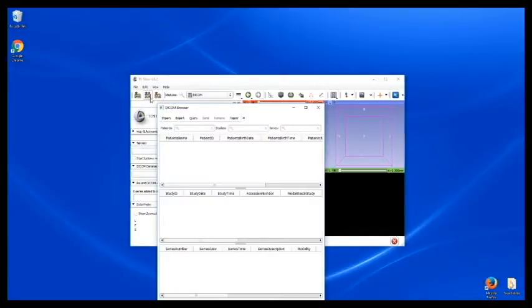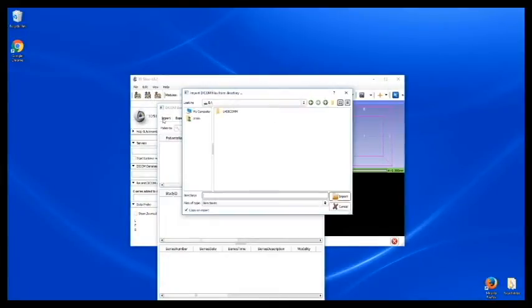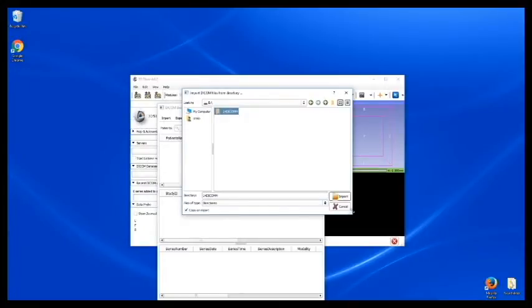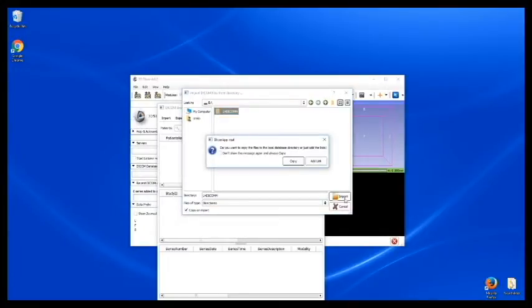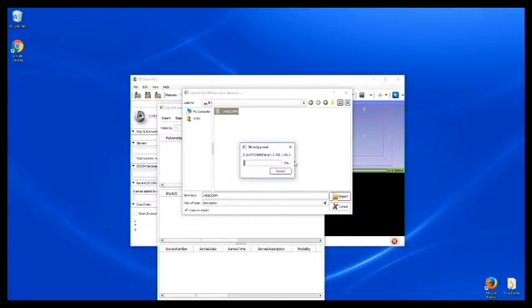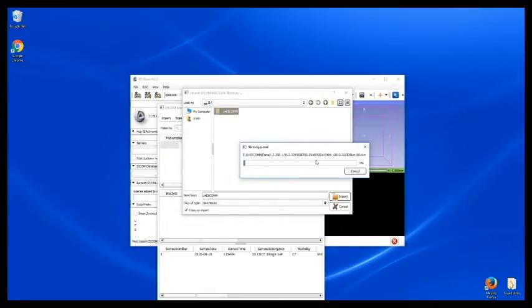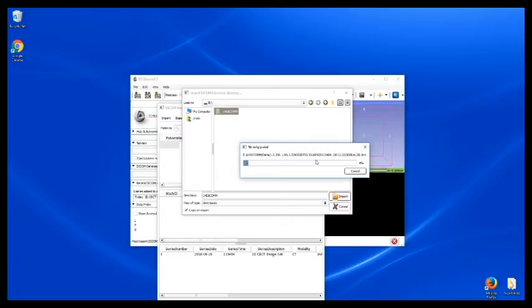For DICOM data I will come here and import, and I'll just import the entire folder. This may take a while to upload everything. It is a lot of information, a lot of files here.